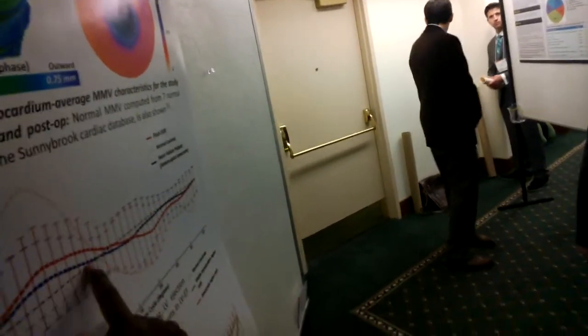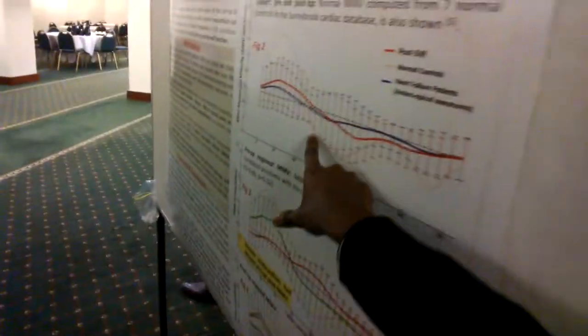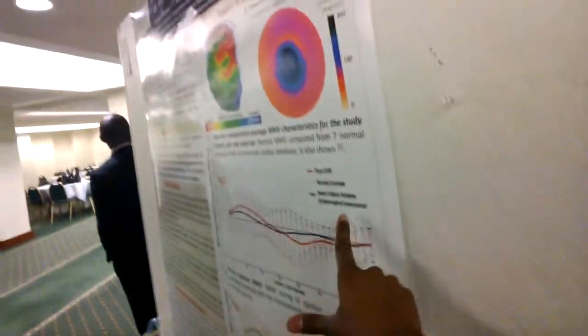And then I track the motion history of each point on the surface and come up with a displacement history over time. Average that over time and then plot a displacement history characteristic and benchmark it against a set of normal patients. So our study cohort of heart failure patients had a mean myocardial velocity history characteristic given by this blue line, which was far diminished in comparison to the amplified motion of the normal controls.